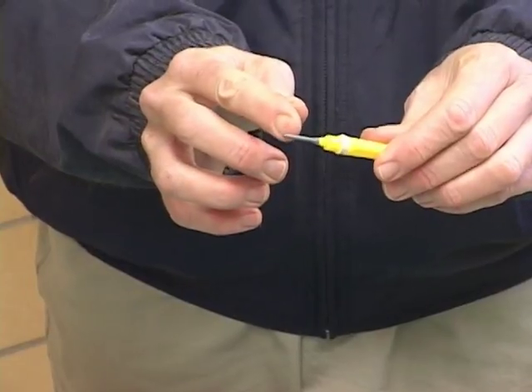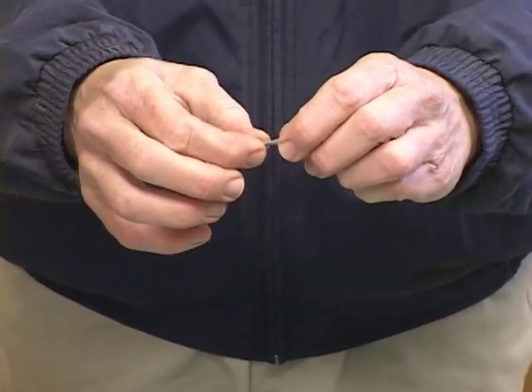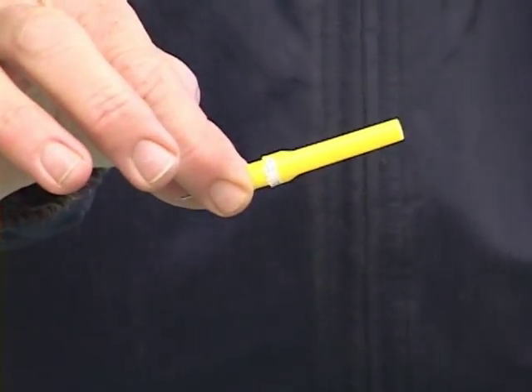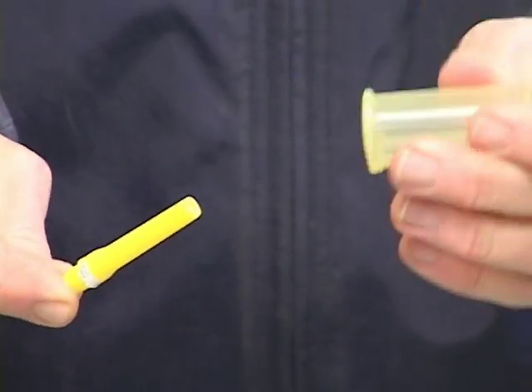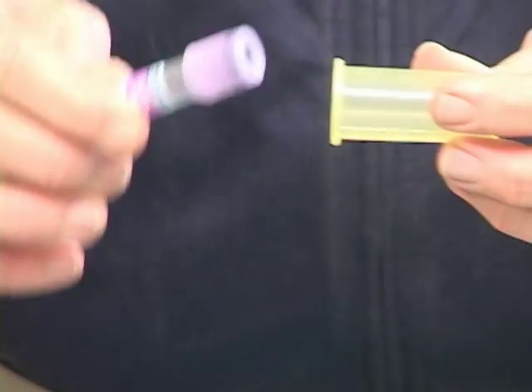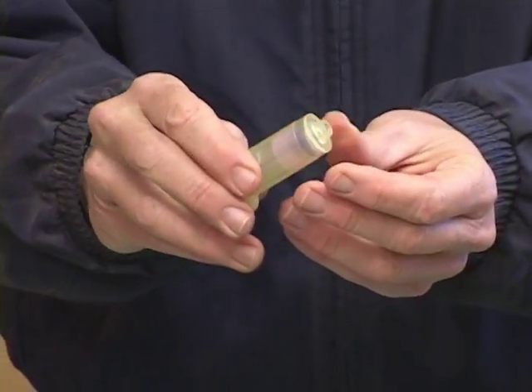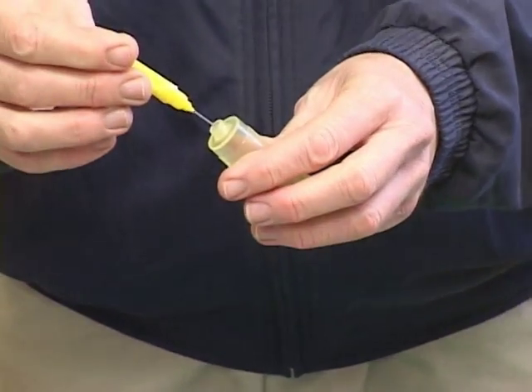The tube end of the needle has a little rubber guard on it. I'm going to pull it off for demonstration purposes so you can see — it's just a needle like any other. Many practitioners and most MDs like to use a stabilizer for their vacutainer needle, which means you can place your tube inside the stabilizer. Once you've put the needle onto the stabilizer, you can screw it on right like this.